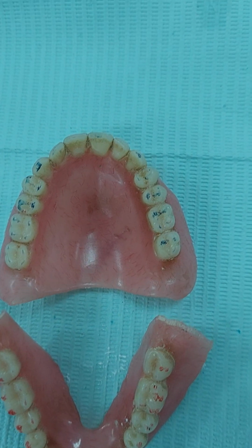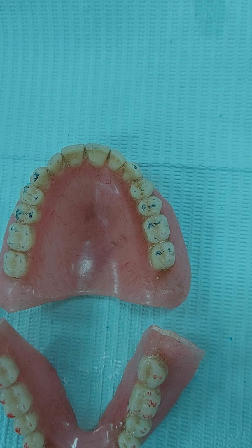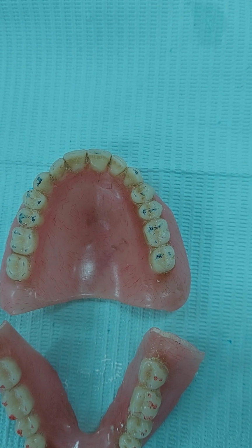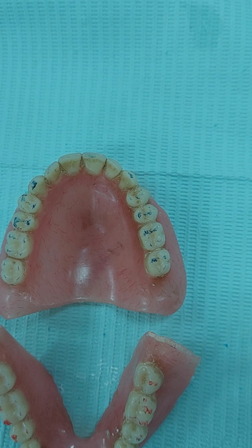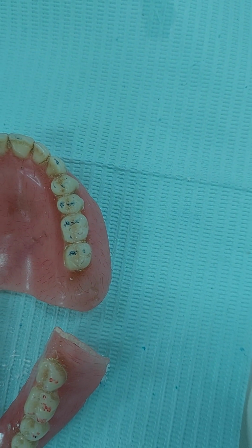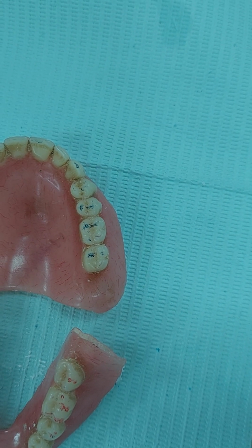Now go to the premolars. What do I see on the non-functional cusps? On the non-functional, there is a heavy contact. Yes. So the non-functional, especially on the 5, I'm going to reduce it. We also see on this side, this is more equalized. I will accept this here. The buccal and the lingual are taking the same heavy spots.